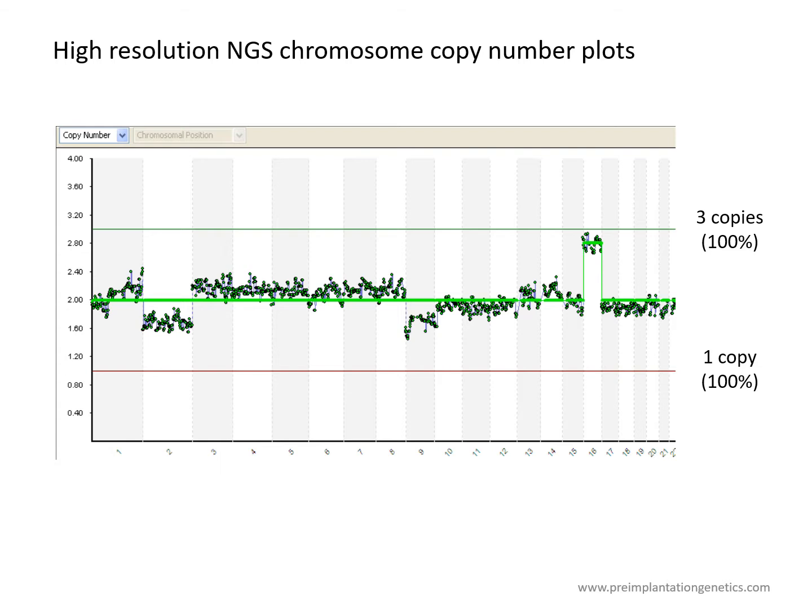Also, there are clearly 2 intermediate copy number losses for chromosome 2 and 9, but these displacements are only a fraction of that expected for a full monosomy, which would be indicated by the lower, what should be red, but in this particular profile looks a grayish line at 1 copy.